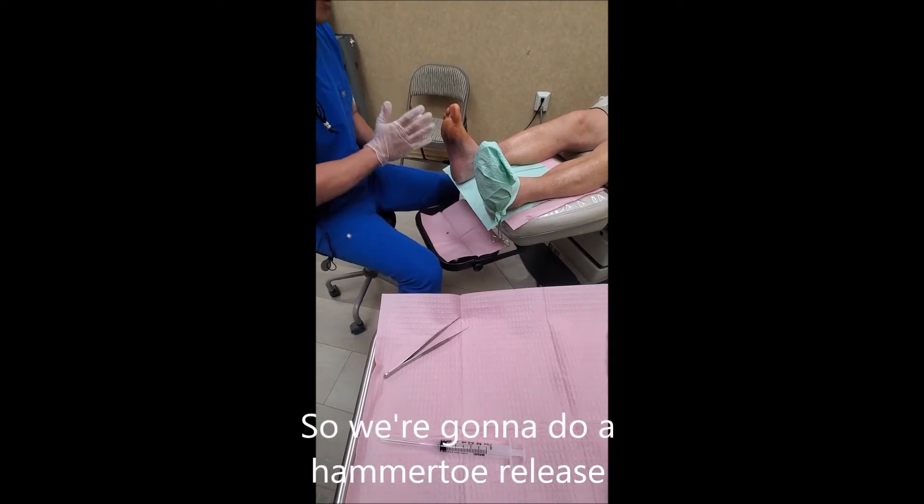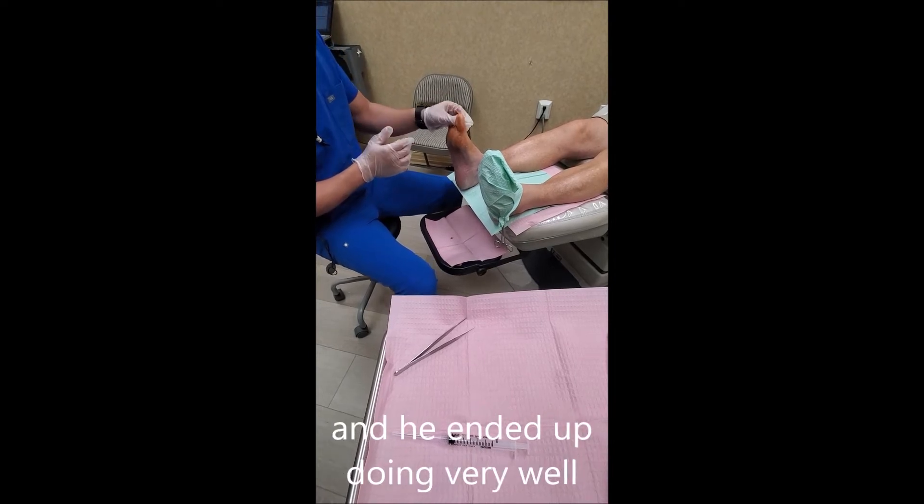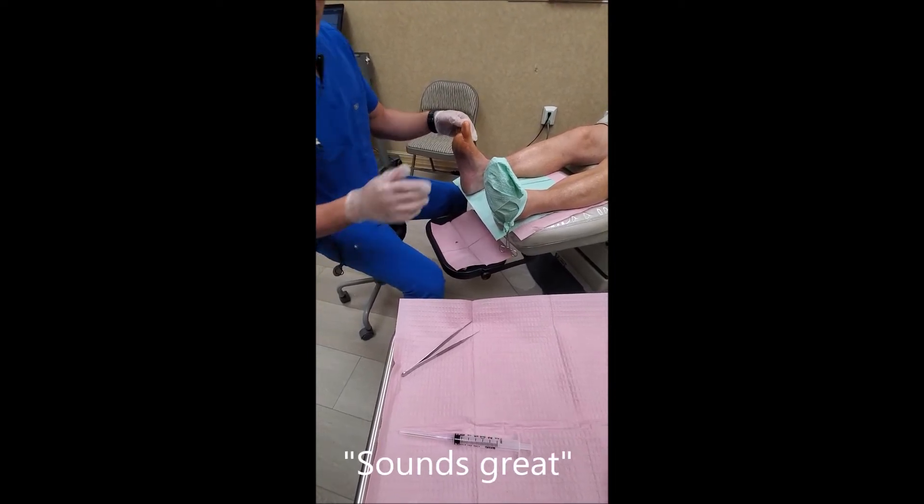We're going to do a hammer toe release — he's already numbed. We did it on the third toe in the past and it ended up doing very well; we're going to do the second toe. Let's do it.